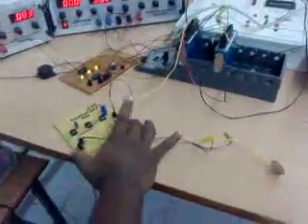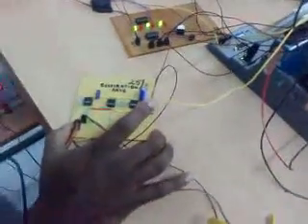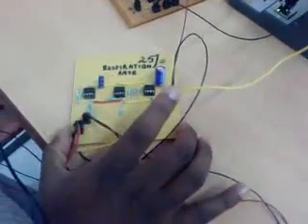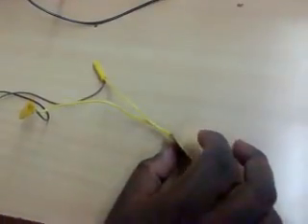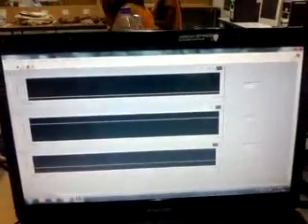This is a respiration rate circuit which senses the respiration rate of a person. It may be tied to the tummy using a belt, and we are using a piezo disc as the sensor. Piezo disc has a good sensitivity. If we have a small touch, we get a pulse waveform which can be shown there. In the first graph, whenever I am touching here, you have a pulse, and this pulse has been counted, and the counting program is done using LabVIEW.